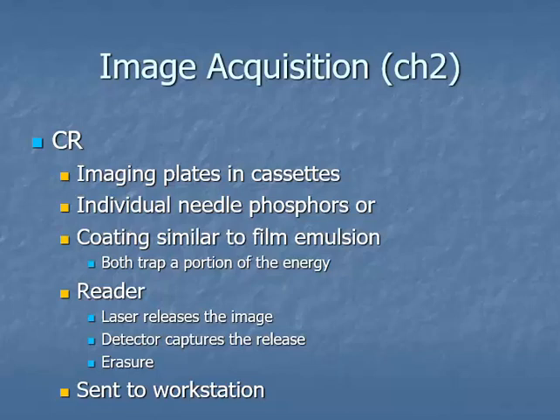So what happens, if you remember, you've got two different scan levels. In both cases, what you've got is a laser that scans across it. So you got a fast scan and a slow scan. And the slow scan is nothing but the travel of the plate. So the plate travels through the reader, kind of like on a conveyor belt. But the fast scan is really what's going on with the read itself. So you got this laser that pivots and it scans across the face of the plate.